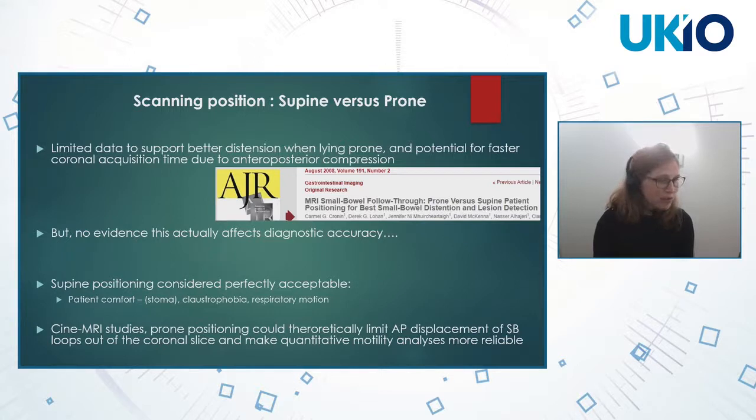However, there is no evidence at the moment that this actually affects the diagnostic accuracy of the study, and it's perfectly acceptable to put the patient supine as well. And a lot of patients will be more comfortable supine and therefore will stay still.